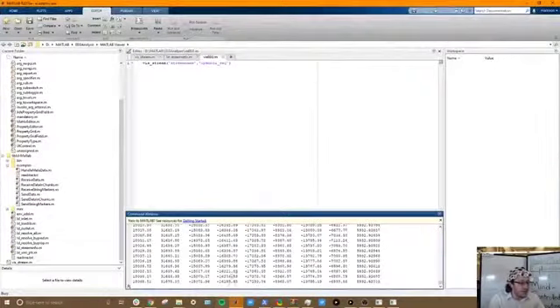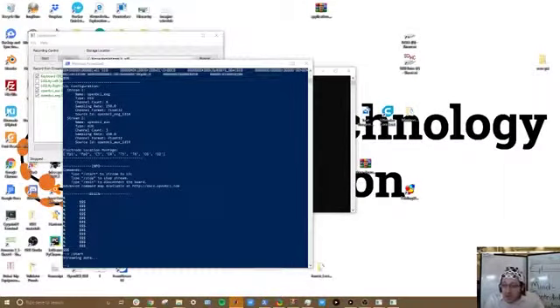Yeah, so you can see here we can actually receive some data in LSL. So this is one example of a received data stream going on. And if I cancel this, MATLAB is just not being very responsive today.